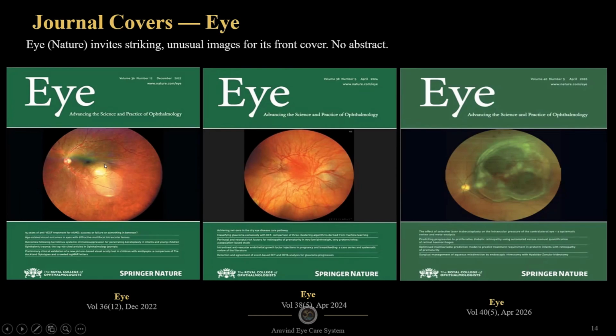The first image is that of a choroidal granuloma. Can anyone say what is this finding here? Some thick whitish thing that is here. What is it? You know hypopyon in the AC, anterior segment. This is posterior hypopyon. From the granuloma, it starts leaking and settles here.